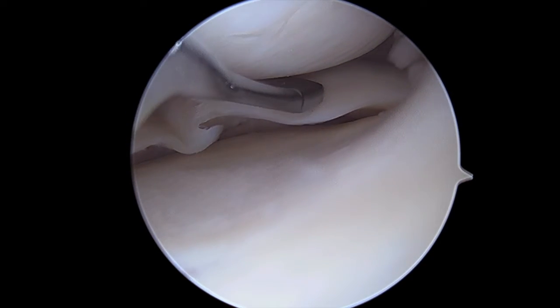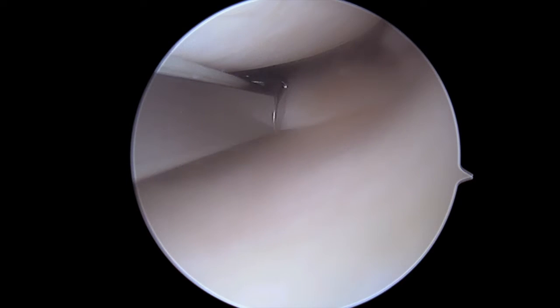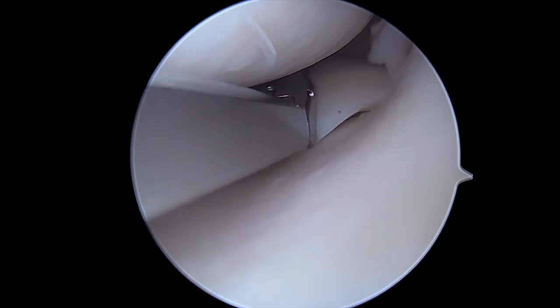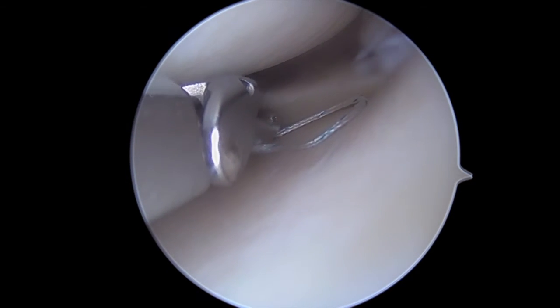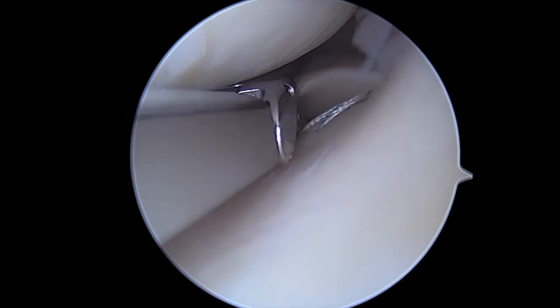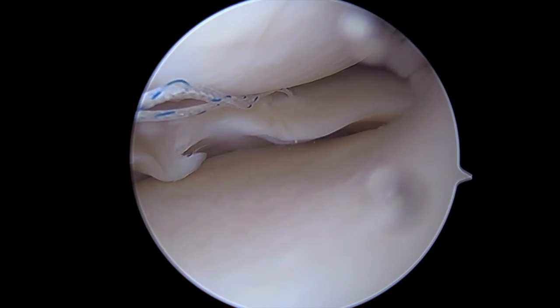We bring in our Nova Stitch Plus device. We're going to get all the way back to the meniscal capsular margin. I've trephinated underneath the medial meniscus, which allows my lower jaw to penetrate beneath the meniscus, get around the meniscal capsular junction, and then pass my second suture more near the central margin of the meniscus, with my second suture captured in the upper jaw. Now I can tie my meniscus back to the meniscal capsular junction.